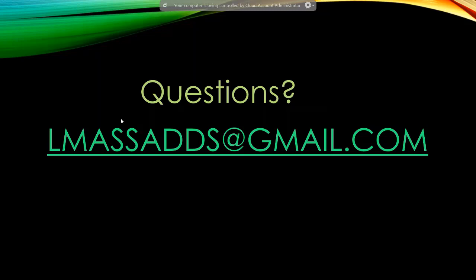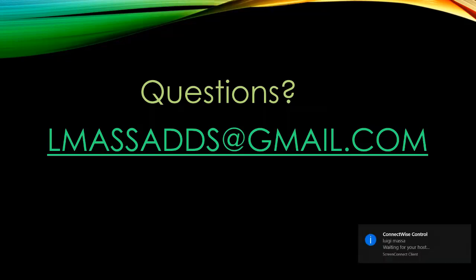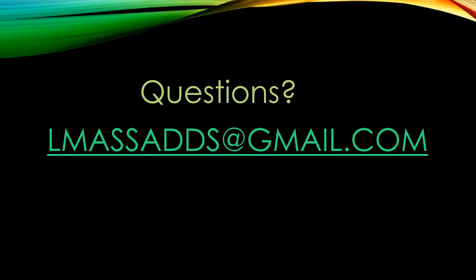Got another question here. Can we use any other software to design the guide for Implant Direct? Answer is yes. You just have to have a software that is compatible in that they allow you to upload libraries for Implant Direct. There's many third-party softwares out there which do allow you to do that. I don't know all of them, but I imagine ones like Anatomage and Vivo, all of the major planning softwares generally today have worked with all of the implant manufacturers to make that available.